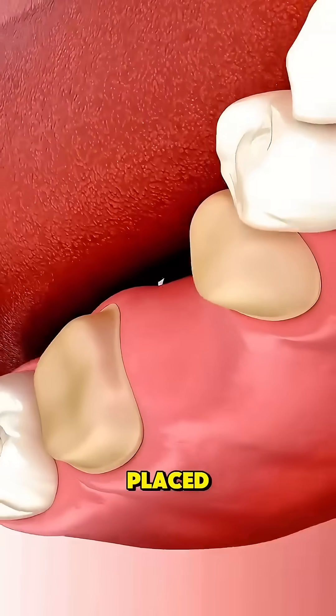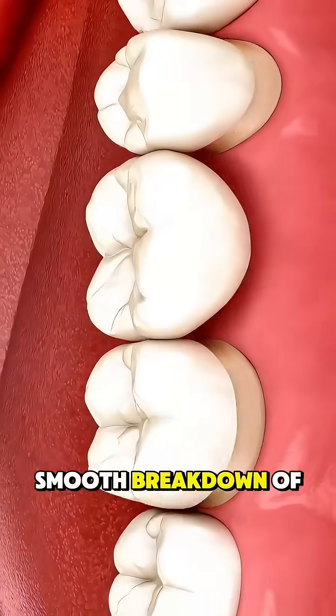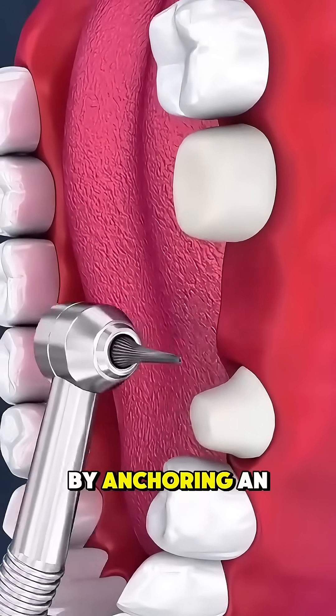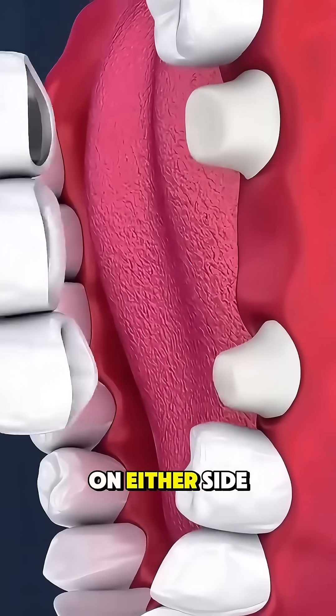Ever wonder how dental bridges are placed? Here's a simple, smooth breakdown of the process. A dental bridge is used to replace a missing tooth by anchoring an artificial one to the teeth on either side.